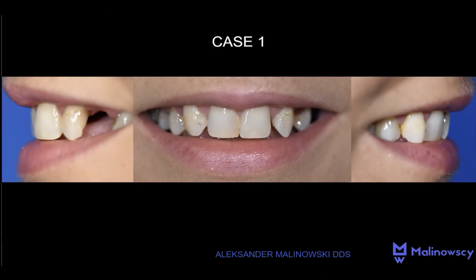I will discuss all the mentioned advantages in detail based on the cases presented below. Each case has been carefully selected to easily explain the benefits and functions of the facial scanner through their examples. This allows us to better understand how the scanner improves the quality of work in the fields of prosthodontics and implantology.